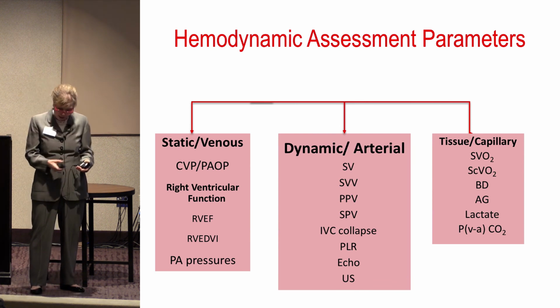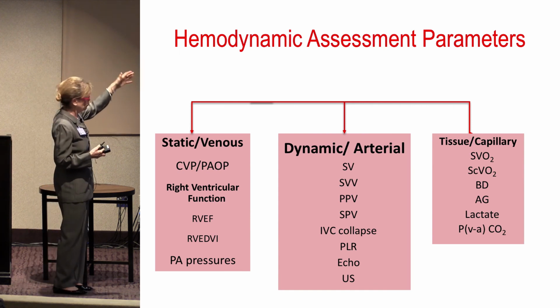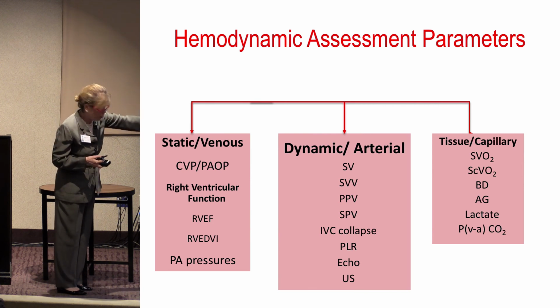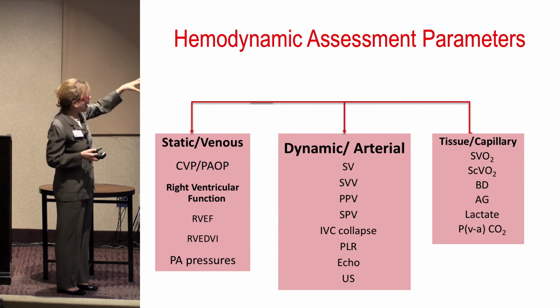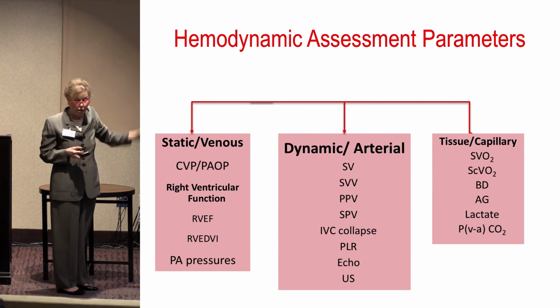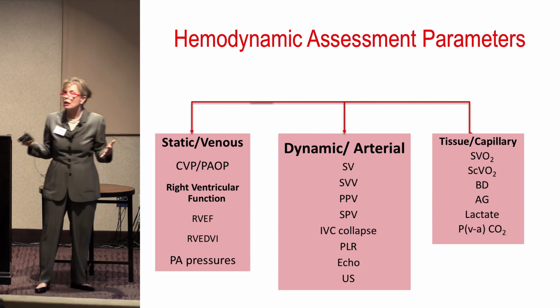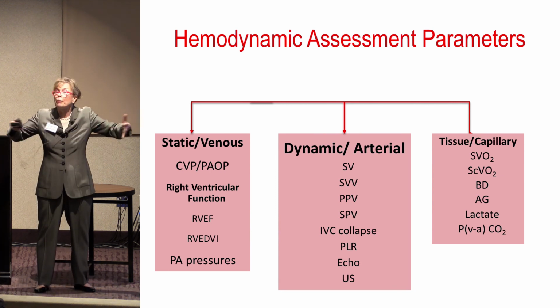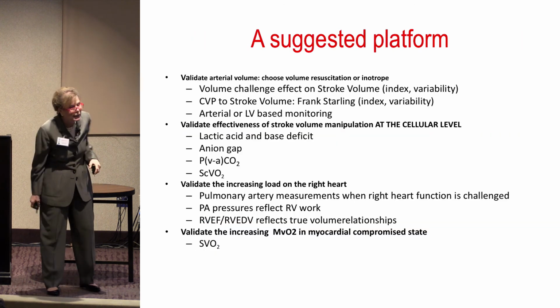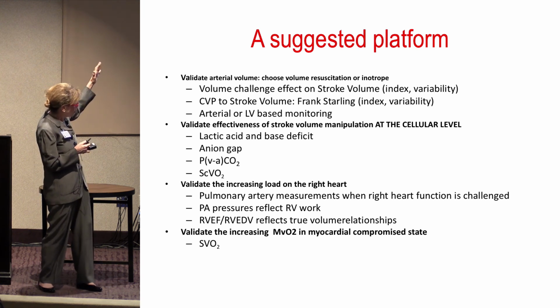And looking at that all together in terms of perfusion, how we actually can incorporate one, which would always be what we look at the tissue, and then adding a methodology to look at arterial volume resuscitation, and then considering a methodology to look at your deoxygenation and the deoxygenated blood flow. And that's the wide platform. The sicker you are, the more catheters you're going to get. That's what I say.